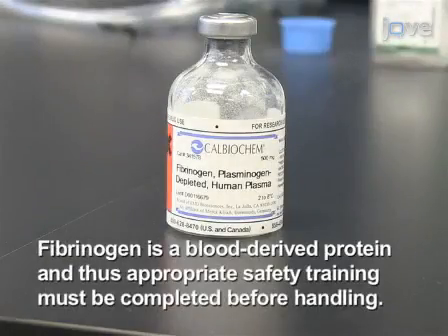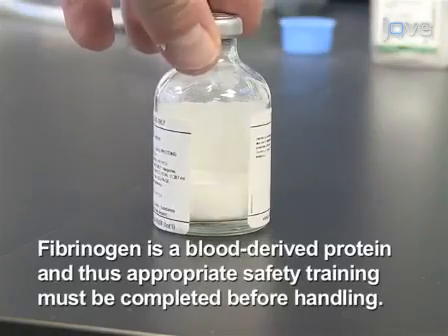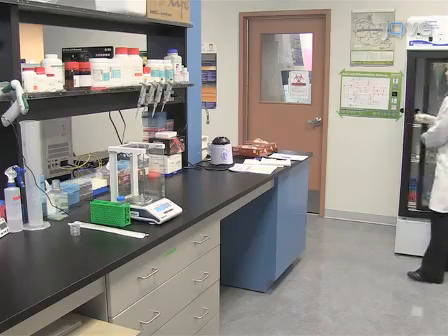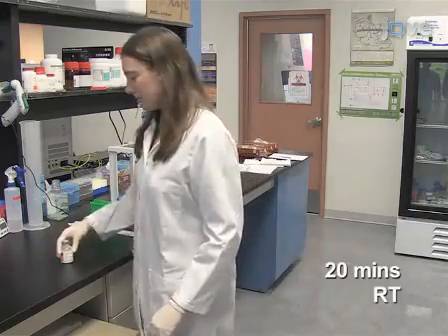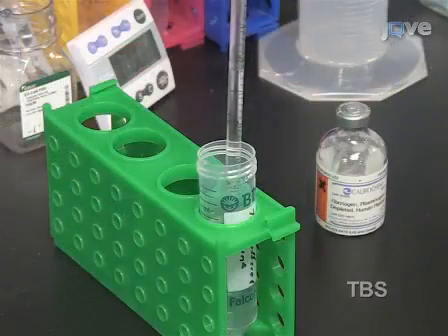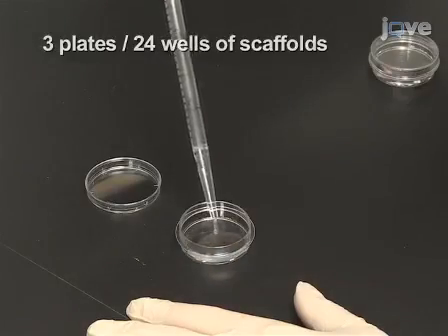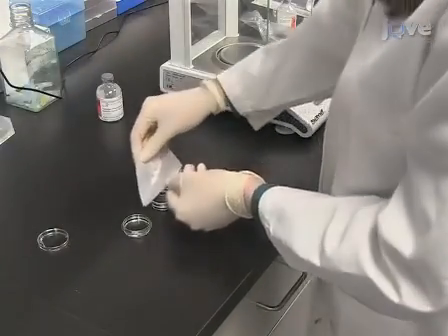Fibrinogen is a blood-derived protein, and thus appropriate safety training must be completed before handling. To begin, remove lyophilized fibrinogen from the refrigerator and allow it to sit for 20 minutes to come to room temperature. Add 3 milliliters of tris buffered saline to each 35 millimeter petri dish, weigh out approximately 100 to 130 milligrams of fibrinogen, and sprinkle it onto the surface.